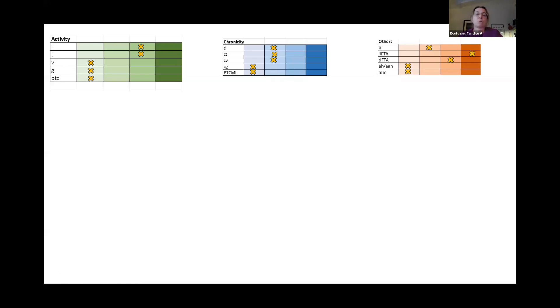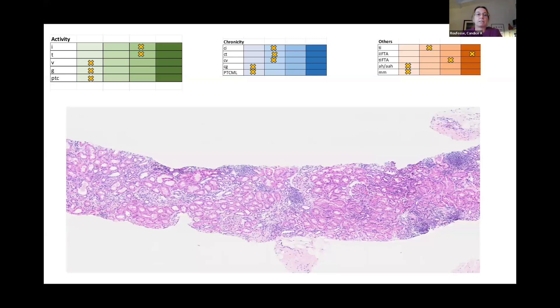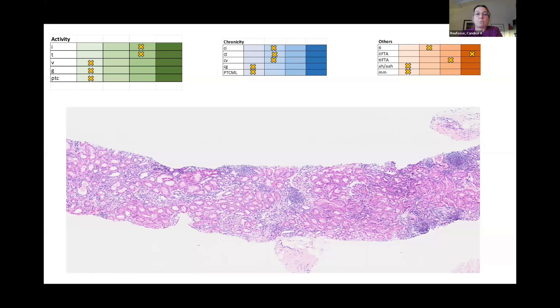Here in this case, in this example, a biopsy with quite a bit of tubular interstitial inflammation but very little chronicity. And if you compare that to another biopsy showing an increase in chronicity and higher total inflammation scores, you can also start to visualize how that biopsy might differ from the previous one that you saw, and that it has more widespread chronicity and more widespread inflammation as a proportion of the total cortex.